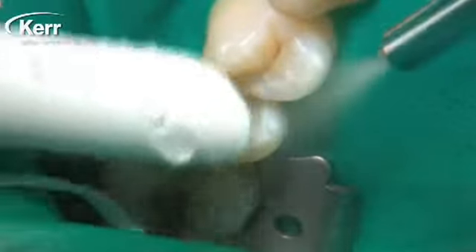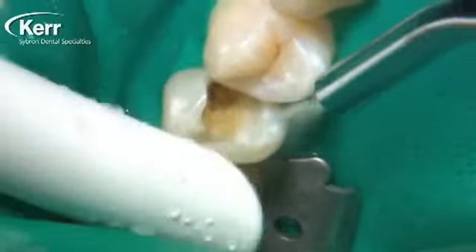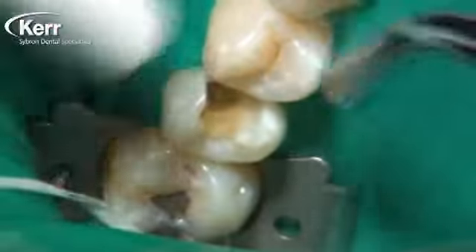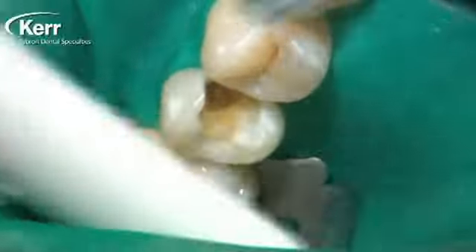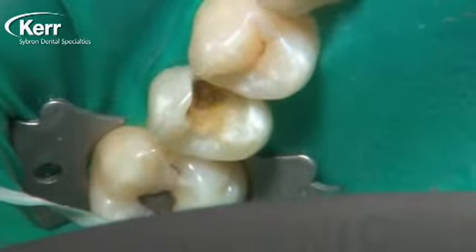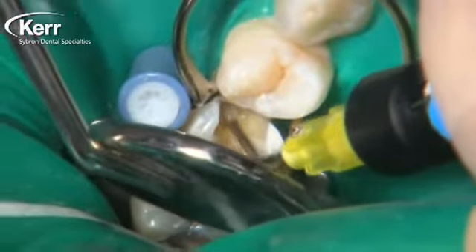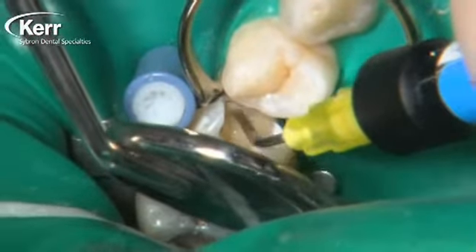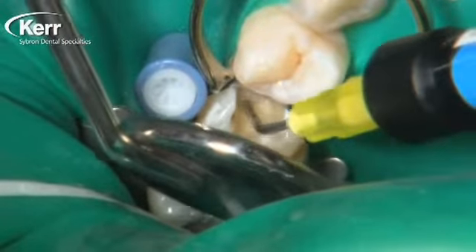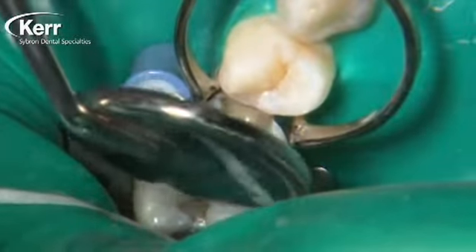Once we finish the preparation, we're going to rinse it off as you see us doing here, then dry it with an air blast directly for five seconds. Vertice Flow bonds well to wet or moist dentin, but the highest bond strengths we see are to dry dentin. It's really nice to be able to tell a dentist: just dry it for five seconds like we used to do with enamel. This takes out all the ambiguity of what moist dentin really looks like.